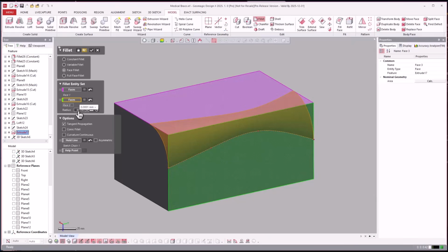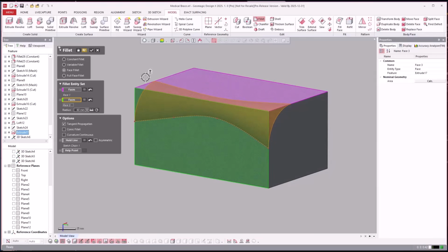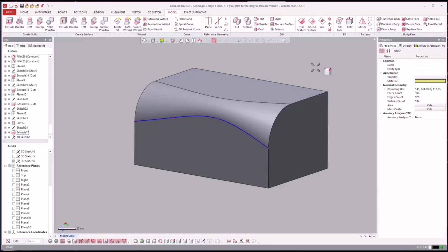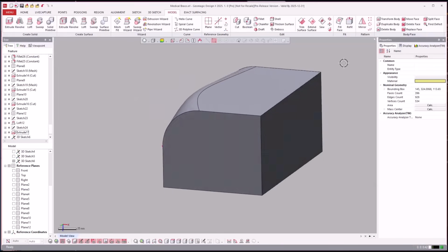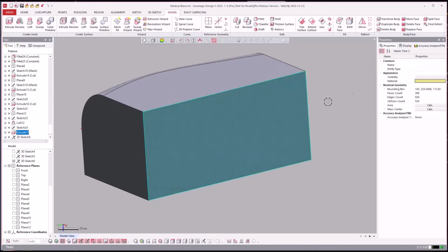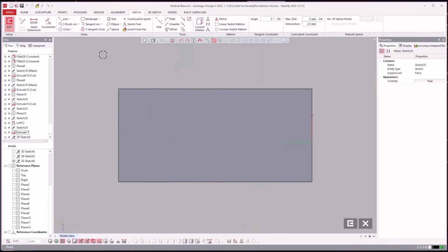So if I just make the fillet dimension bigger than this dimension actually is, look at what it does. So I can use this like guide curve within the fillet to create this variable fillet and hit accept, as opposed to using a variable fillet, right? This is kind of my concept here. Now I want to see something real quick. This is just kind of on the fly. I'm going to come over here. We're going to put a sketch on. I want to see if we can use a 2D sketch to do the same thing.